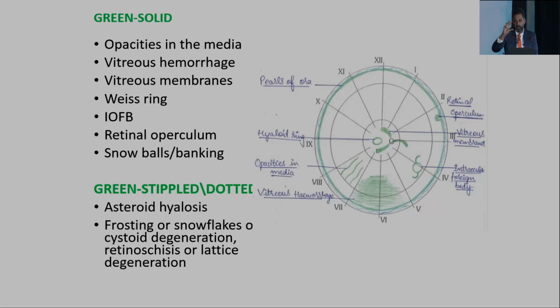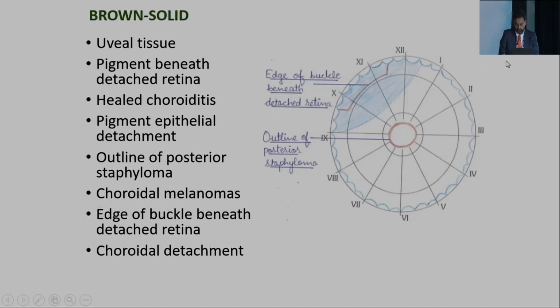Anything within the retina, or pertaining to the retina, for the most part is blue. Anything in the subretinal space, not on the choroid, is yellow, and anything in the choroid is brown. So if you know this, I think for the most part you have 80–85% of your things as far as the retinal diagram is concerned, that's actually sorted.